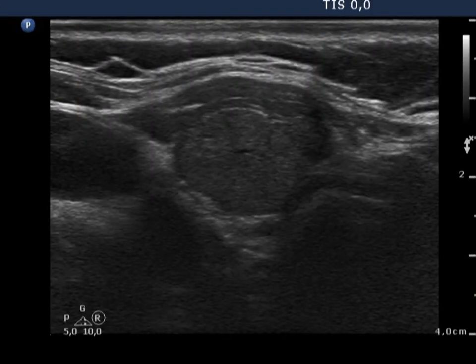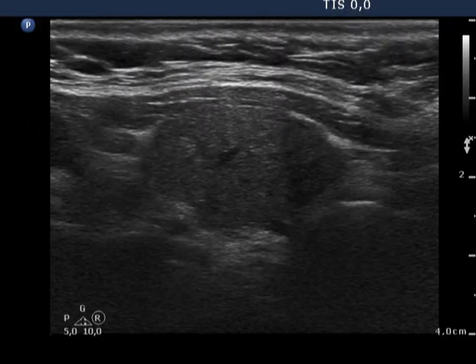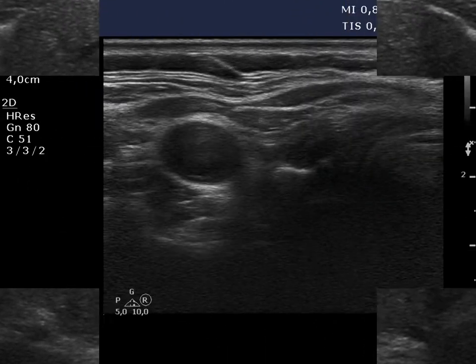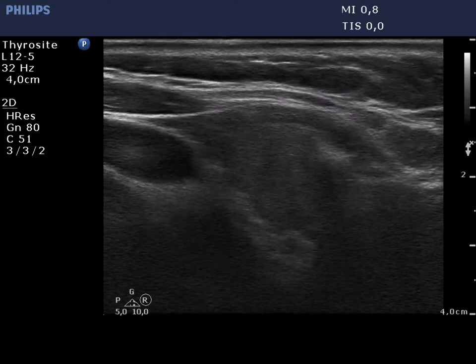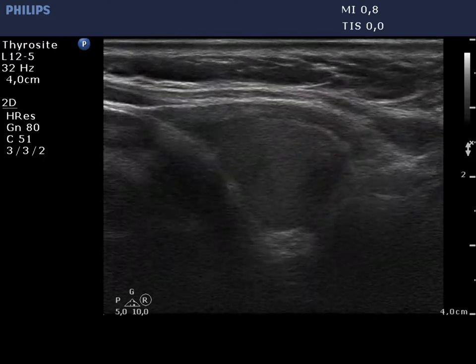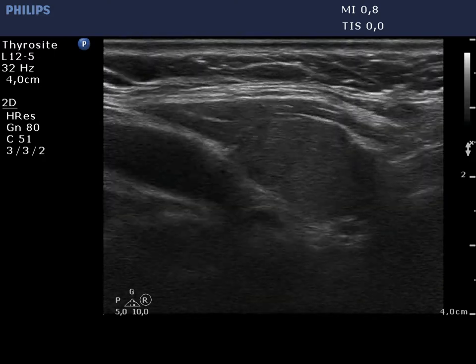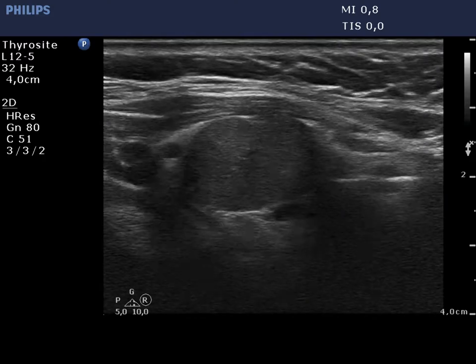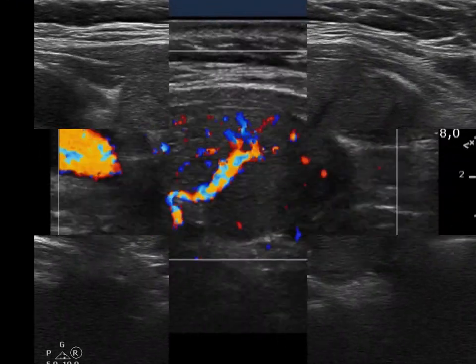The right lobe is composed of a large central hypoechoic part surrounded by an echonoormal rim. This is the typical presentation of a subtotally resected lobe. The thyroid is divided by a more hypoechoic line, which is a vessel.